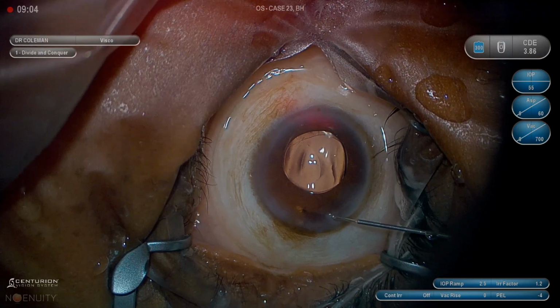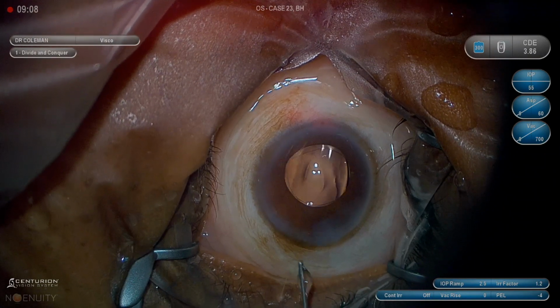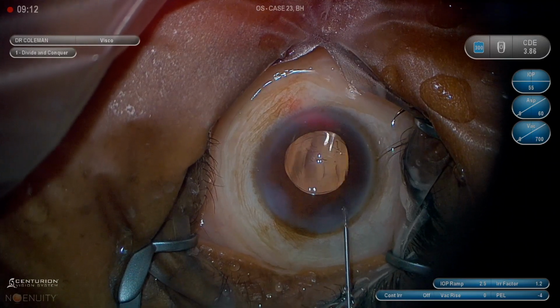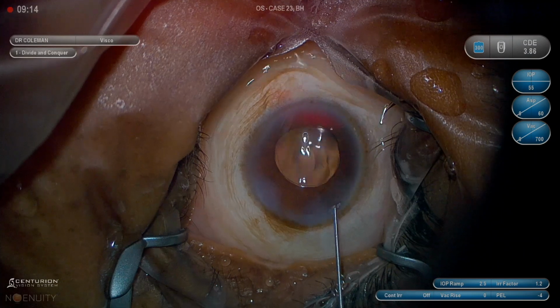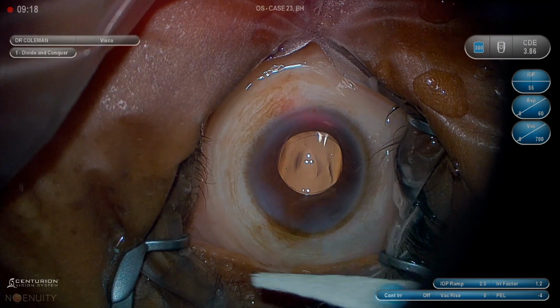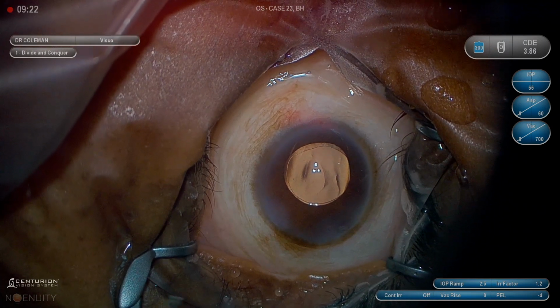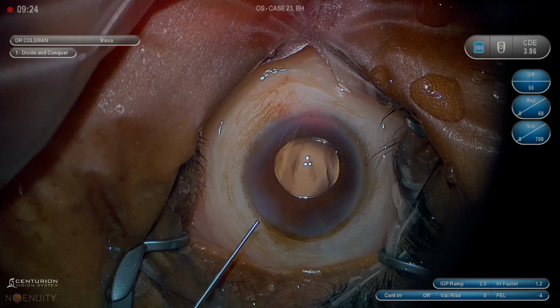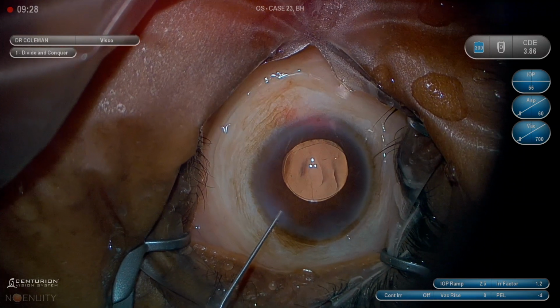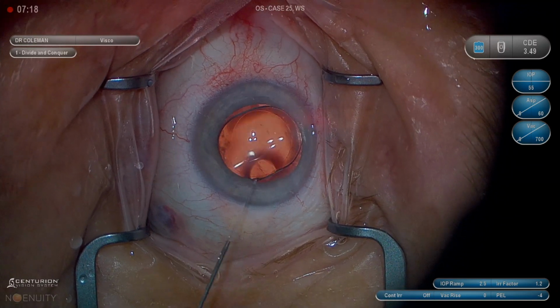That still can be a sealed wound, because when the eye pressure gets back to normal, when you set the pressure as the antibiotic goes in, the wound will completely seal at that point. So you'll see several examples here. In that case, I was burping a little more viscoelastic out. But you'll see several examples in this case series where it's oozing a little bit with the pressure higher than physiologic, higher than you want it. And I don't go back and hydrate anymore. All I do is put antibiotic in, burp the paracentesis slightly, and the wound is completely sealed.